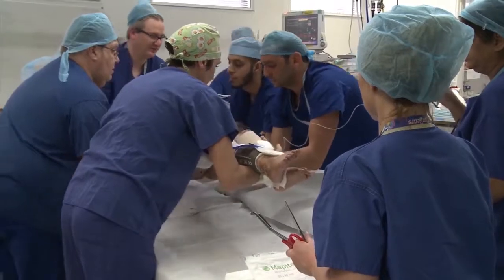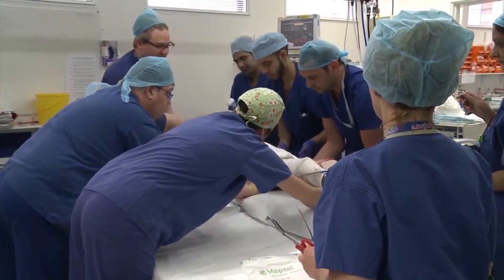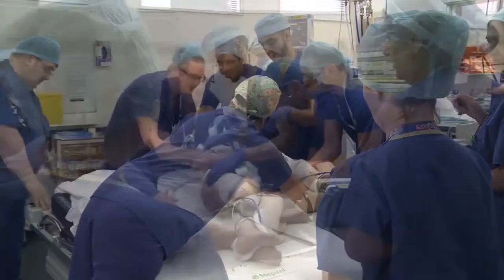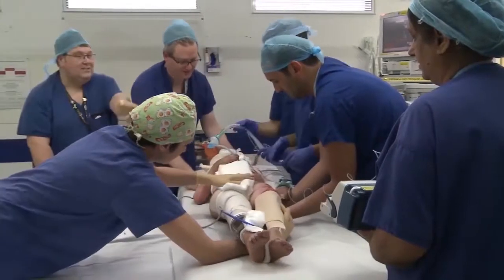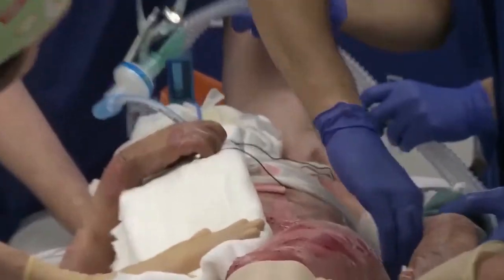Careful transfer and placement of the child on the operating table is required without sliding the patient. The child is placed on an absorbent mattress cover to avoid the skin sticking to the plastic of the operating table. In our theatres, we use an operating table heating mattress to reduce patient heat loss.